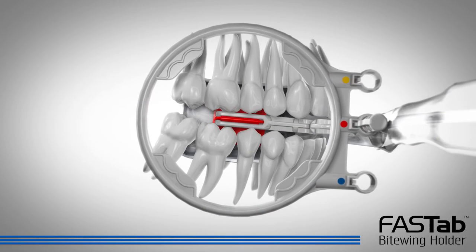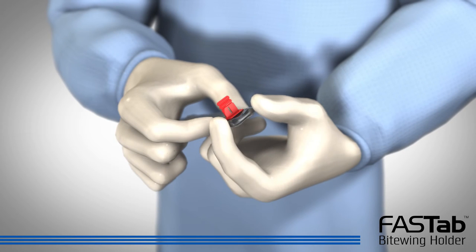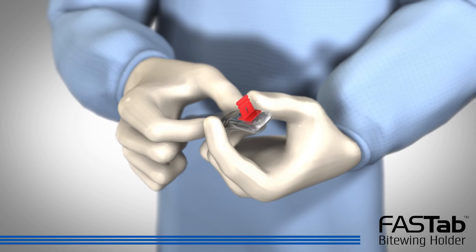To remove the sensor cover and holder when finished, hold the top of the sensor with one hand and with the other hand move the sides of the sensor cover until the sensor is out of the tight section of the cover.